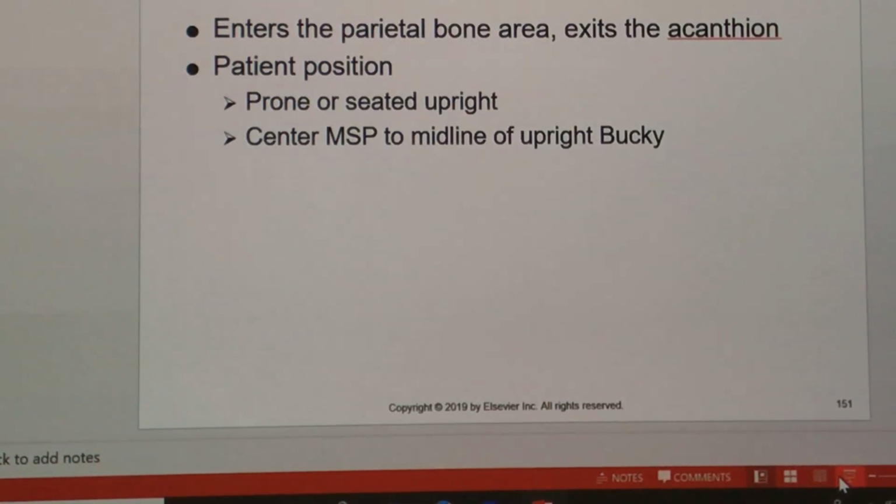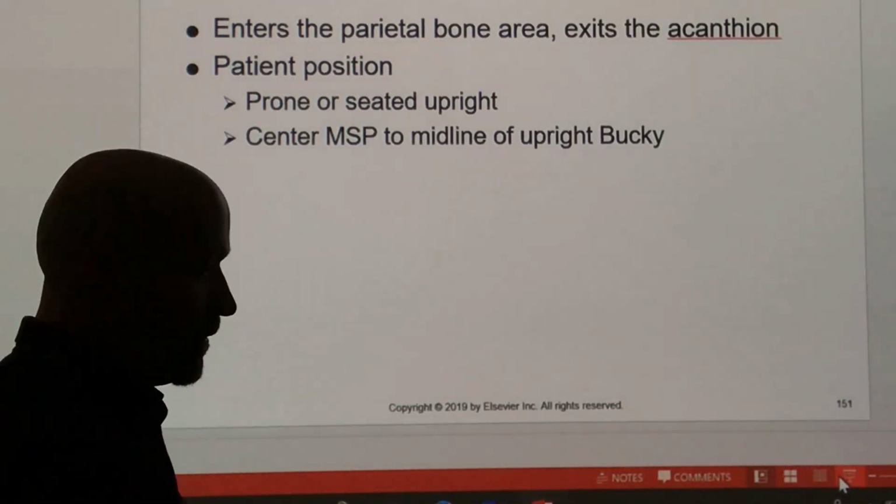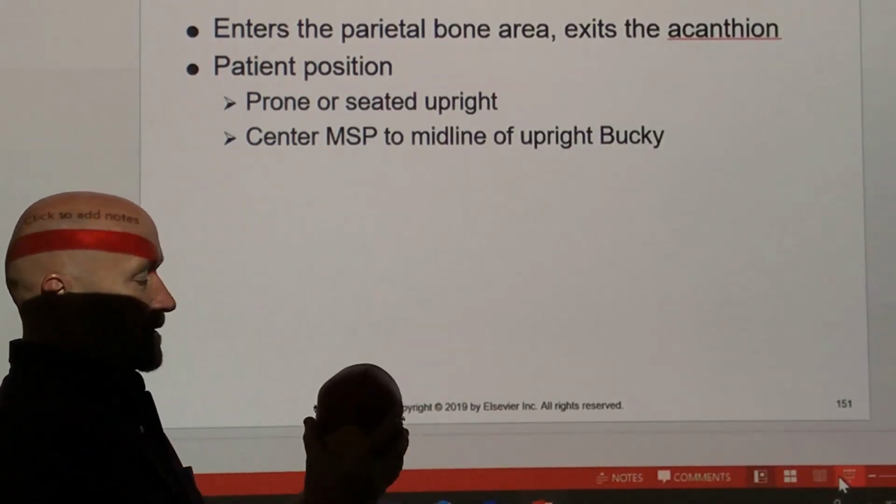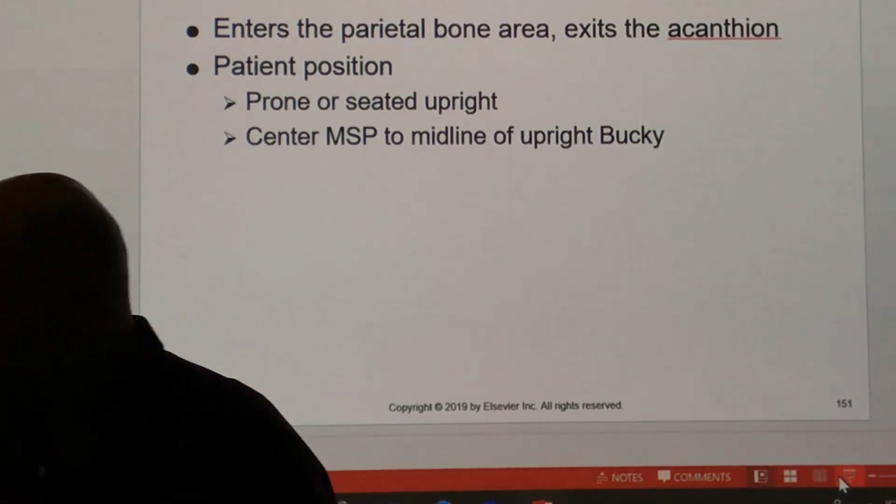So the Waters is probably the most complicated view of the skull, definitely the most complicated view of the skull that we're going to talk about today, but it's probably the most important view of the skull, or it's right up there with the most important views. All right, so I'm going to use 2 different skulls to show this.